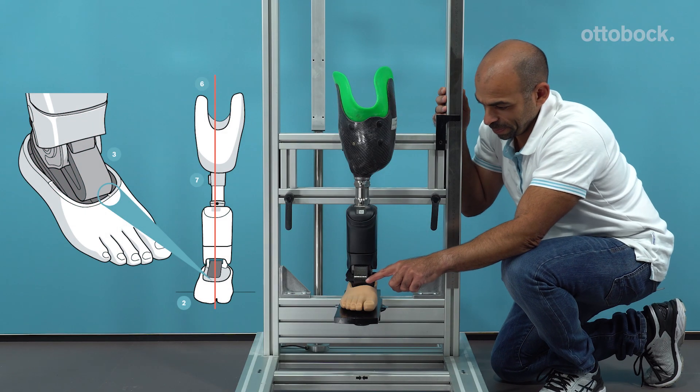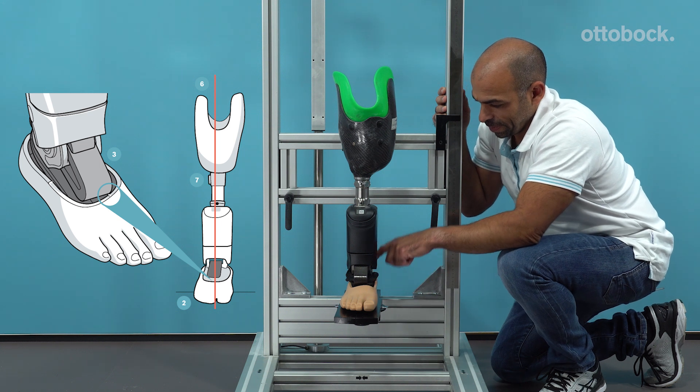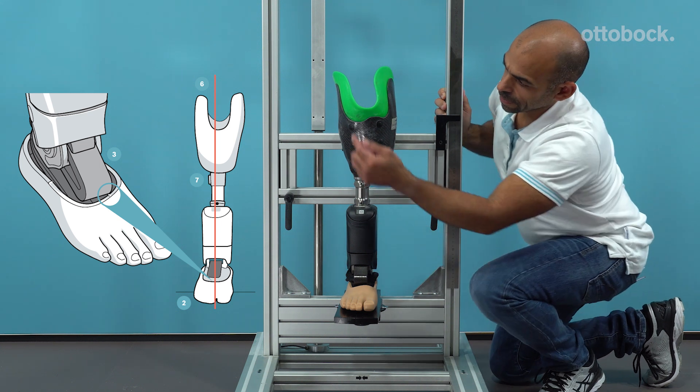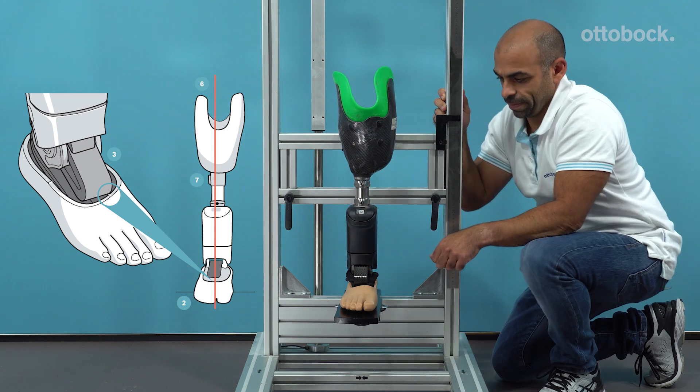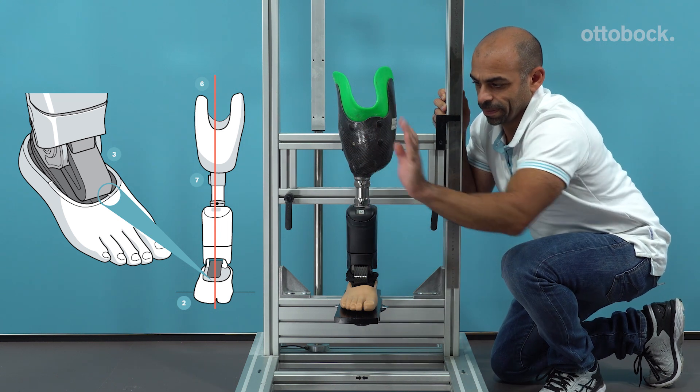In the coronal plane, the alignment reference line should run through the anterior and posterior markings on the foot shell and along the lateral patella edge. Observe the abduction and adduction position.